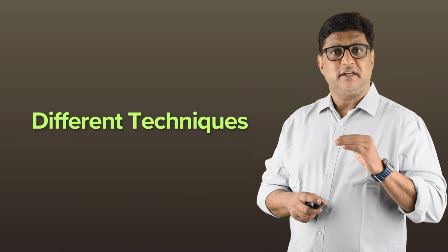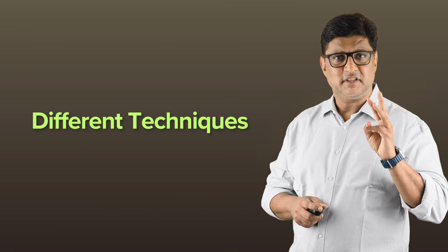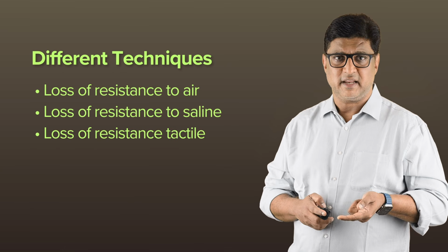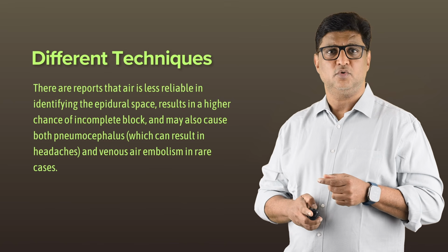Now let us look at the different techniques used to identify the epidural space. So we have three main techniques: loss of resistance to air, loss of resistance to saline, and loss of resistance to tactile feedback. Now, loss of resistance to air.